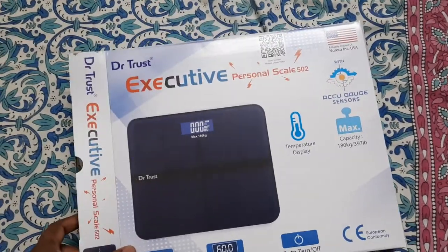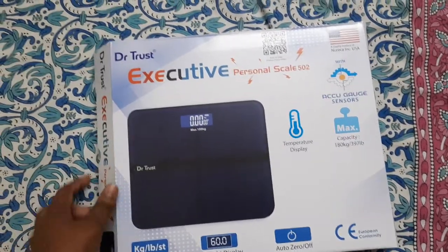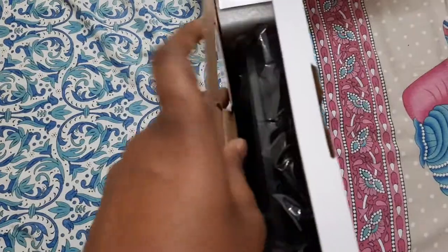Today we are going to look at this weighing scale machine from Dr. Trust. I got it ordered from Flipkart and I just opened it — let's see how it is.